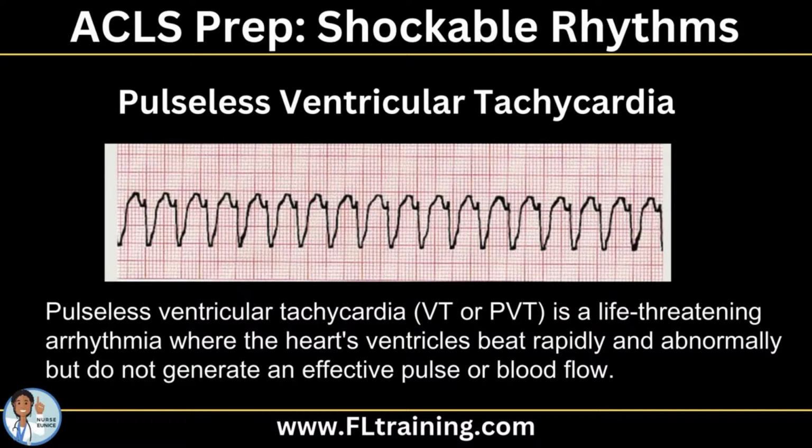Another shockable rhythm that we will be discussing, so we just talked about VF or VFib. That was the chaotic, unorganized, no identifiable P wave, QRS complex, etc. The next we're going to go to is pulseless ventricular tachycardia. Notice that I used the word pulseless because a patient can have ventricular tachycardia and they can still be talking to you. They can still be conscious.